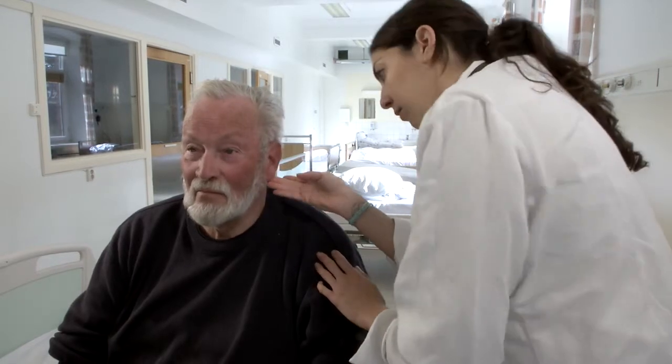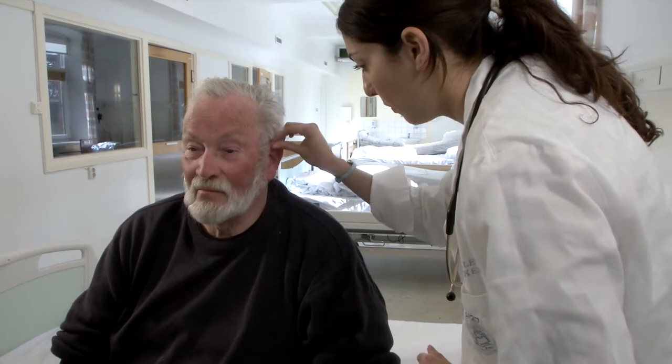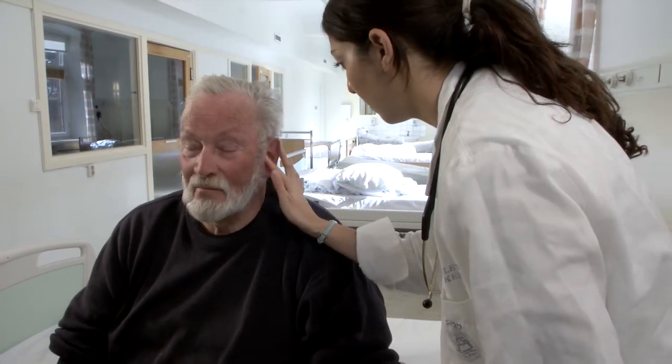Begin by inspecting the external ear. Give special attention to any lesions on the outer ear that may be suggestive of cancer. To palpate the ear, pull on the pinna and push on the tragus. Any pain with palpation may be indicative of infection.